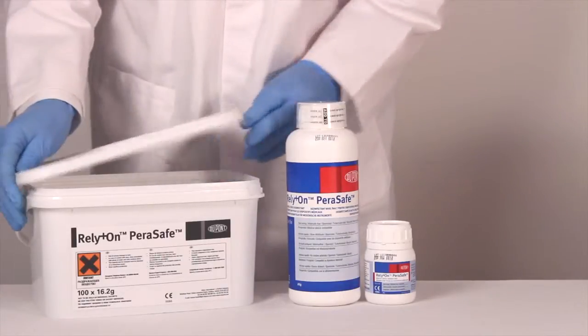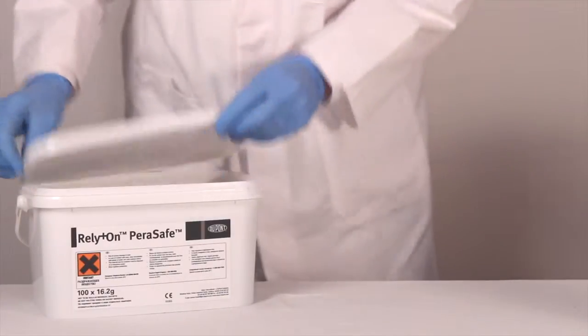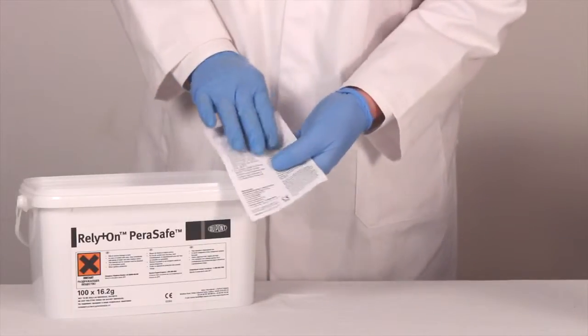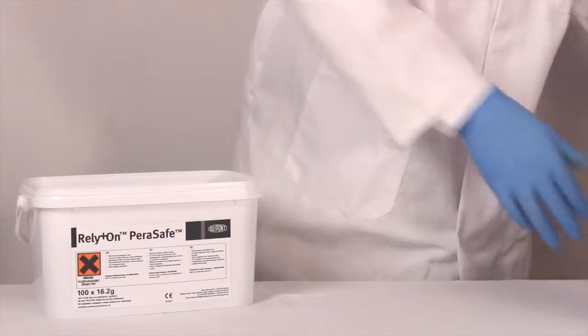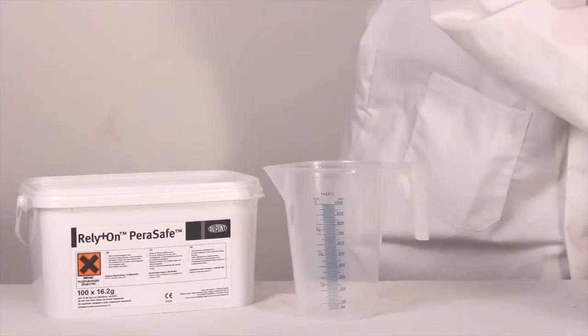In this demonstration we'll be using one of the 16.2 gram sachets. Firstly, always remember to read the instructions thoroughly before mixing any product. For this demonstration today we will need one litre of lukewarm water.